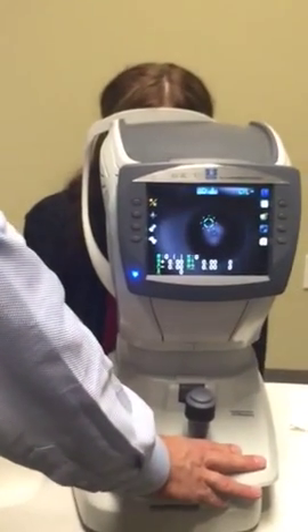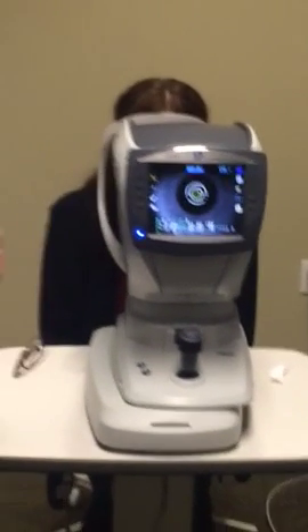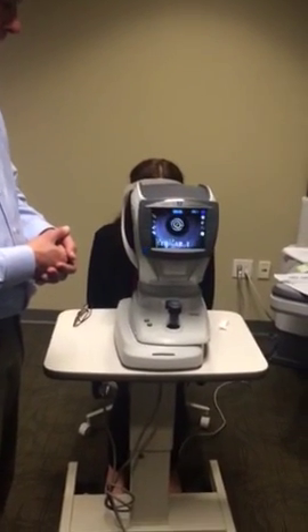Then you go to the other eye and bring it in. Notice it's going to track in and out, side to side, up and down. And we're done.